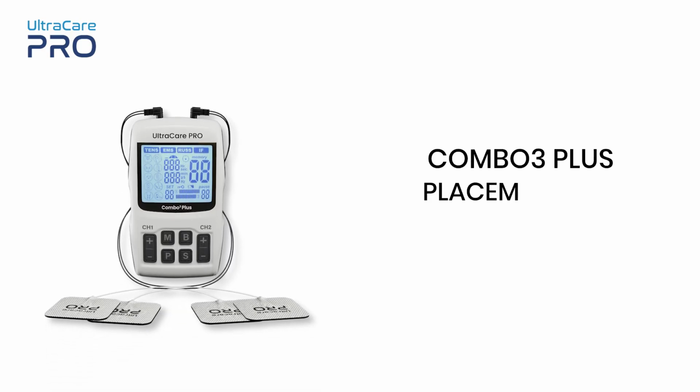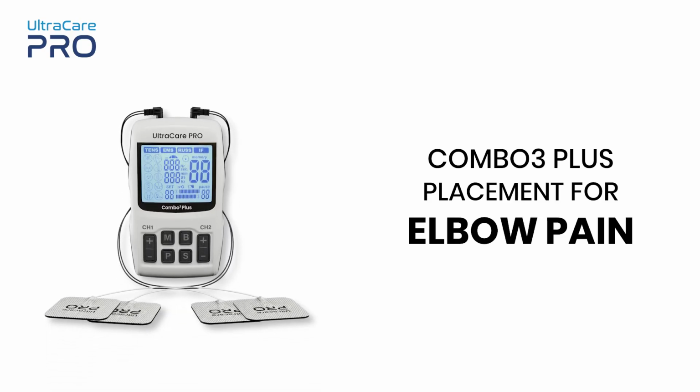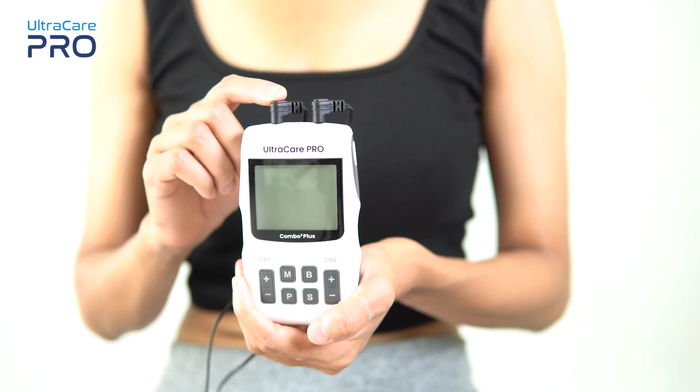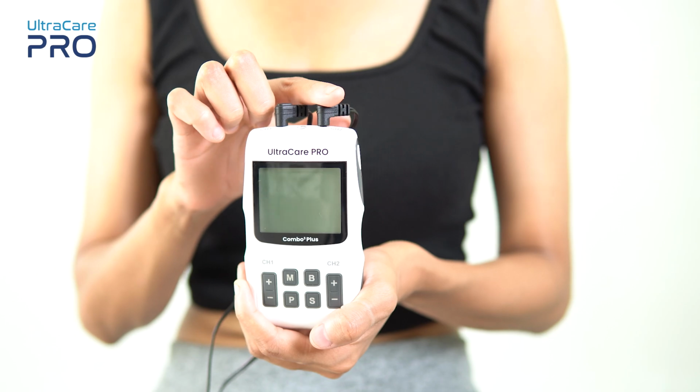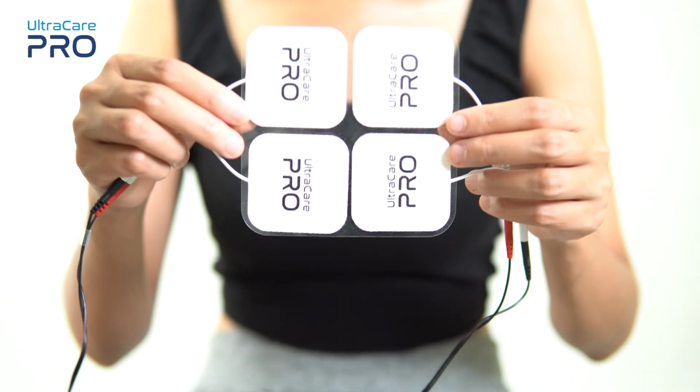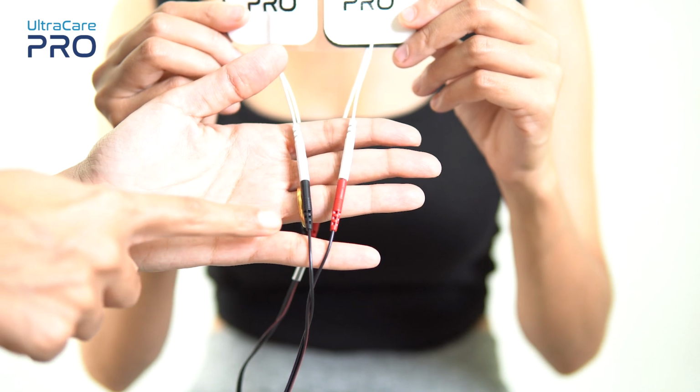Hello, in this video we are going to have a look at the electrode placement of Combo3 Plus device by UltraCare PRO. Wires attached to this electrode comes from channel 1 and channel 2 of this device. Each channel supplies current to two electrodes, one of red color, another of black color.